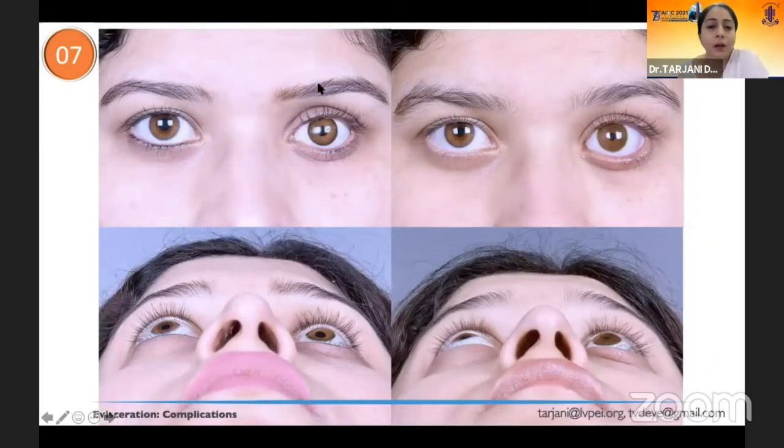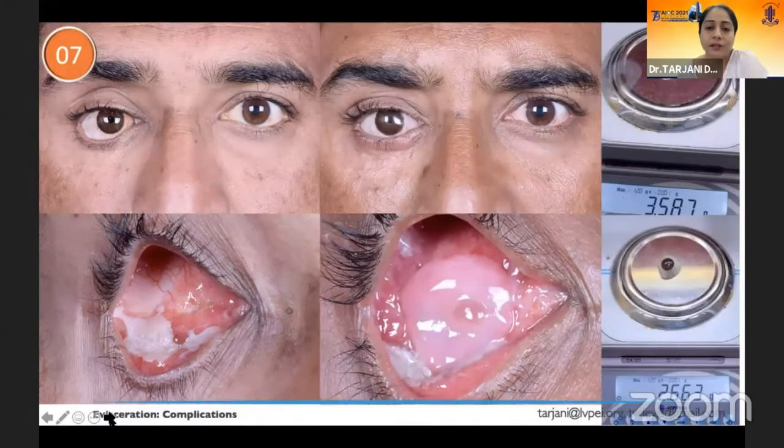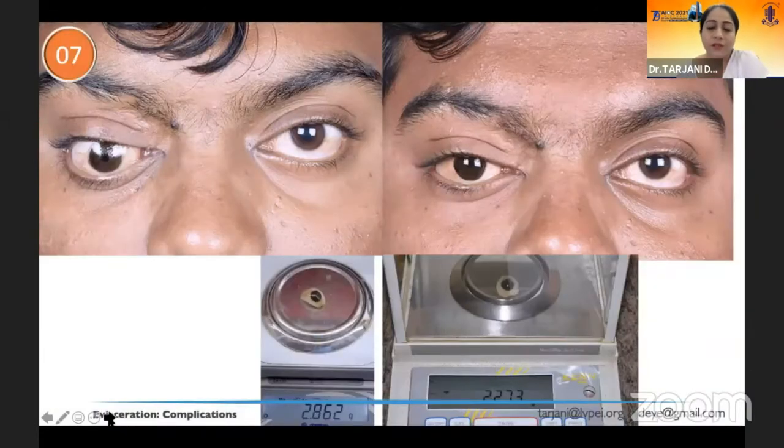Similarly, a young girl who's worried about this sulcus deformity, in whose case we went ahead and injected some fat from the patient's abdomen to give her more permanent results. And in certain situations, you may not have any implant at all, just a plain evisceration is done. And there, where you build in the volume and build the surface with the help of an implant, you can see a reduction in the weight of the prosthesis, which helps you bring the lower eyelid also back in position, because it's not bearing a very heavy prosthetic eye.